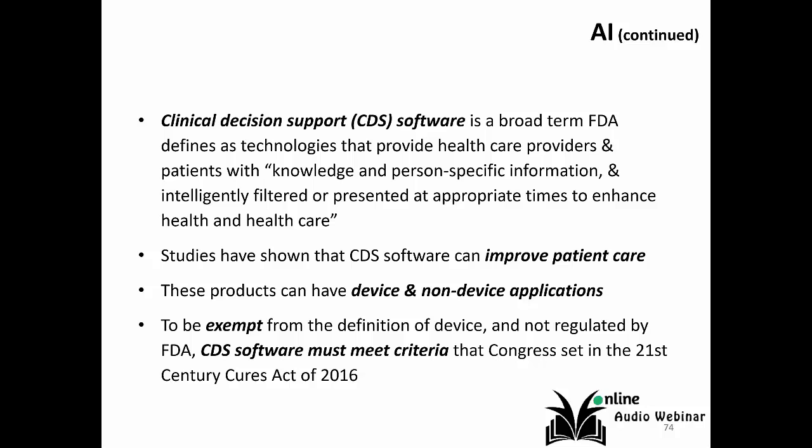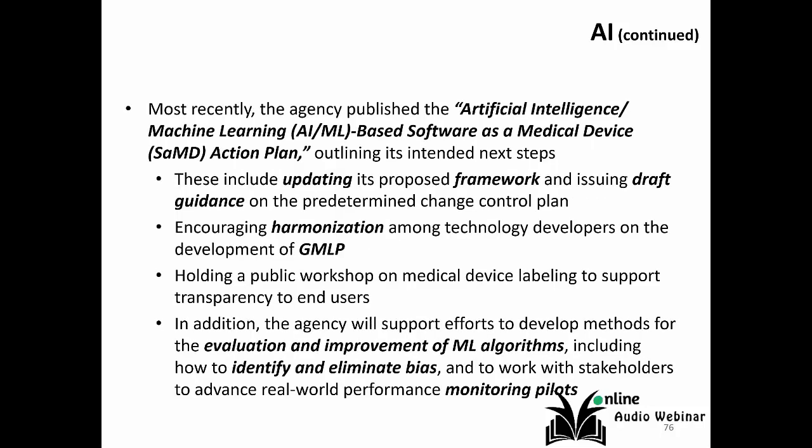Clinical decision support, CDS software, is a broad term that FDA defines as technologies providing healthcare providers and patients with knowledge and person-specific information, intelligently filtered, presented at the right time to enhance and improve public health. Most recently, the agency published the Artificial Intelligence/Machine Learning-Based Software as a Medical Device Action Plan.